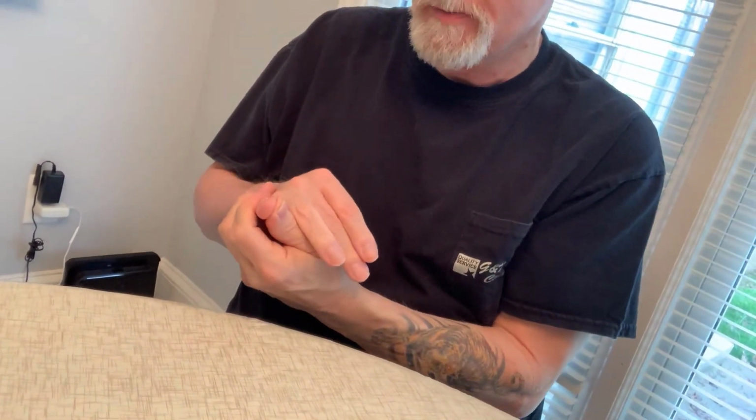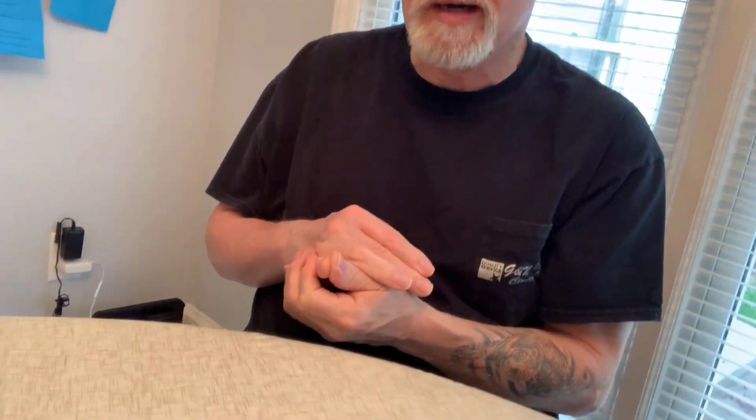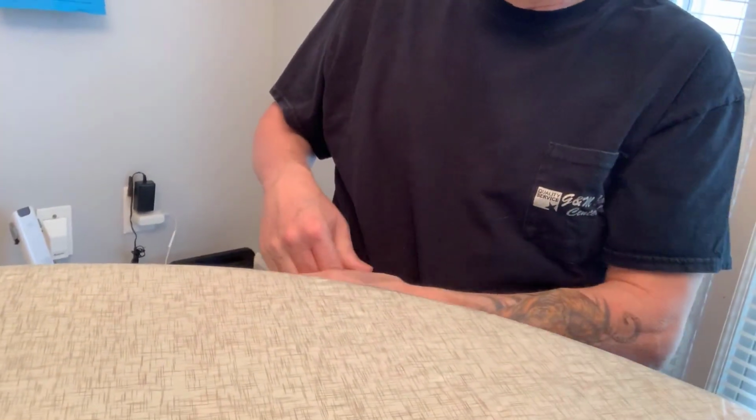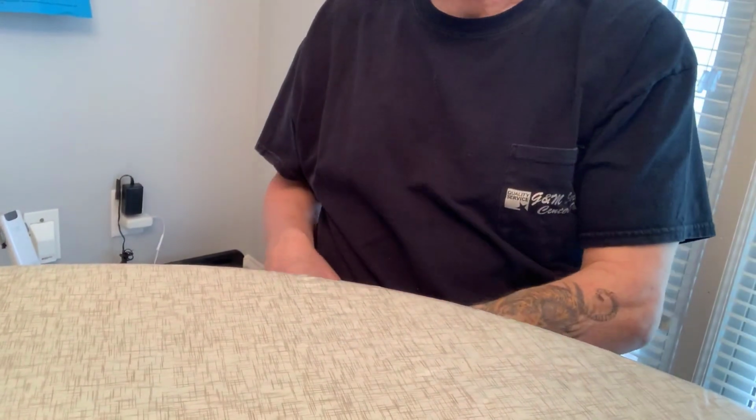See, I just try to get the fingers straight, and the pinky always curls the most. So that one, you try to straighten it out. And then I just straighten them out all the time. I'm sitting there all day long touching it, trying to straighten it out. That's good. That's good. All right.